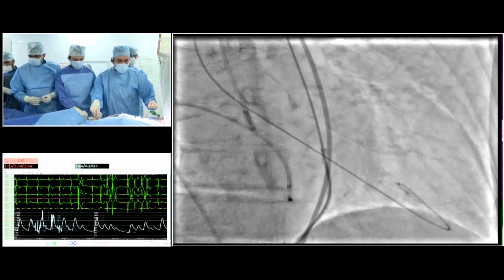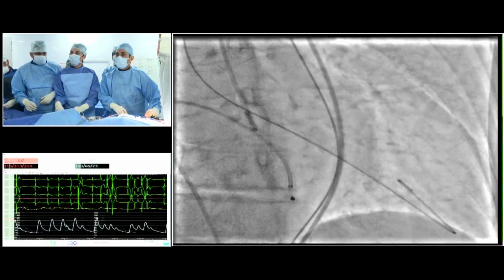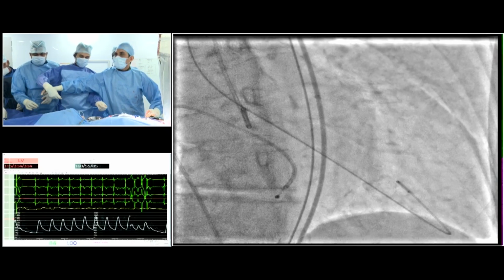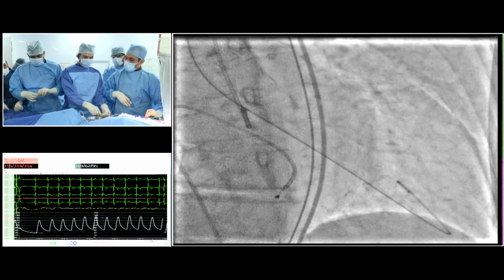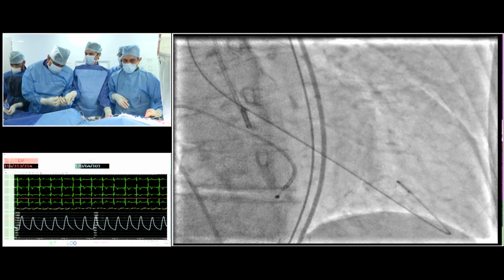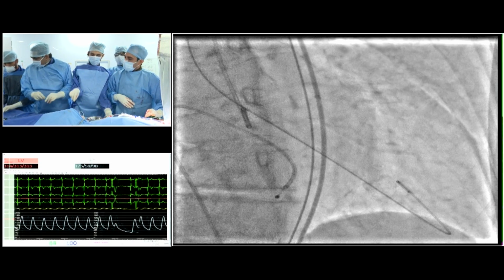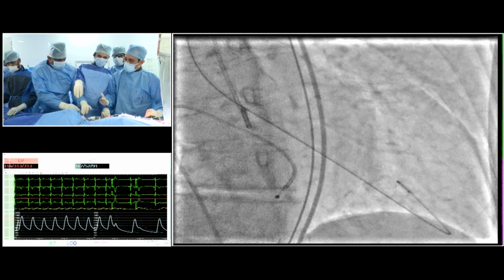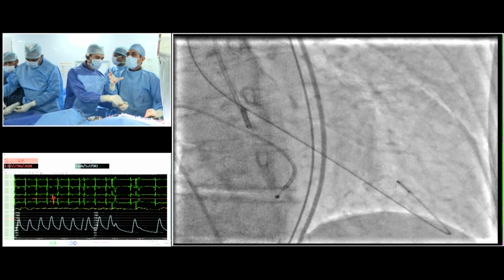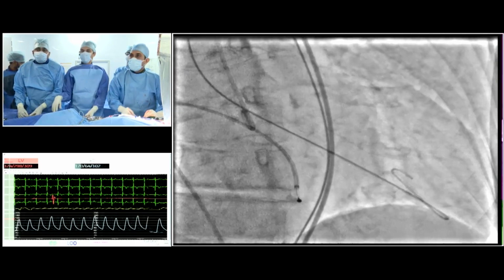I agree. The only challenge which we see in protecting the coronary with a guide is so much calcium in the STJ as well as the left main. If we were using a 21.5, we would have 100% protected the coronaries. But as of now, we are planning to use a 20 valve. Okay. And the sinus of Valsalva left side is 24. We have decided to have our guide and wire ready, and not engage the guide upfront in this very cramped anatomy.